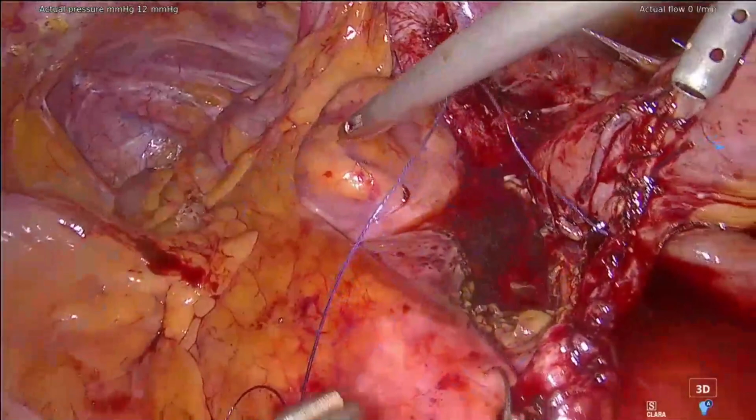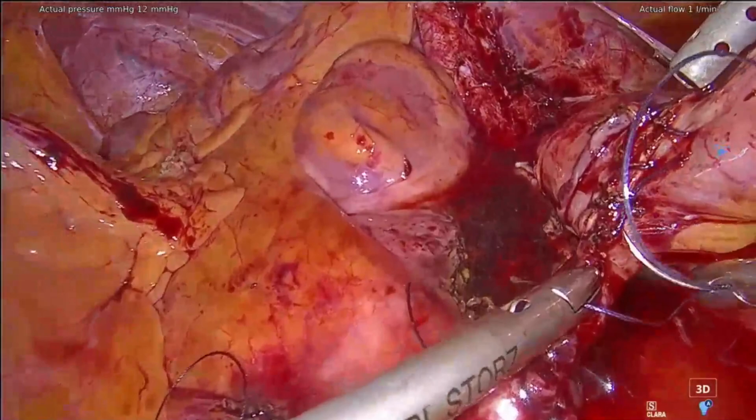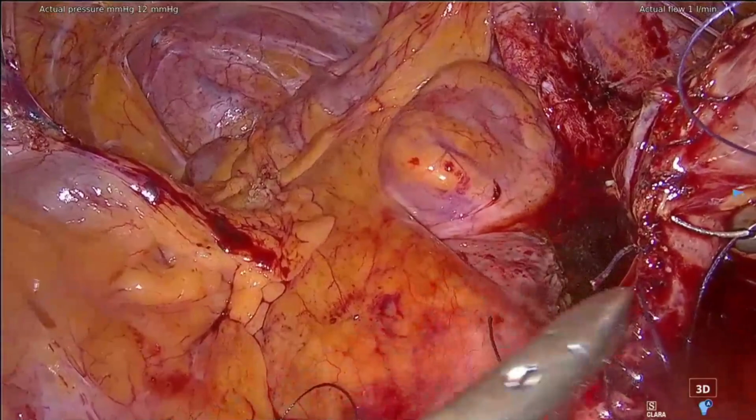But you can also do a disconnected Monti, but you have to reuse a part of the bowel. It's not the same procedure, of course. Here it's just a Monti made starting from the ureter itself. The reason why this is really elegant for me is just because we have used the ureter on the other side already.